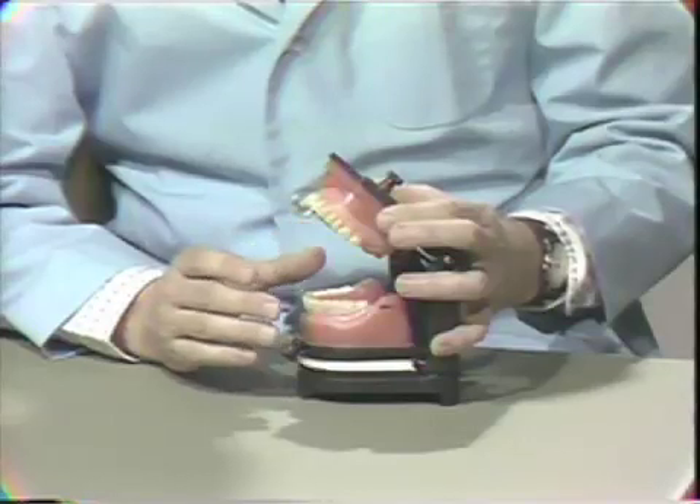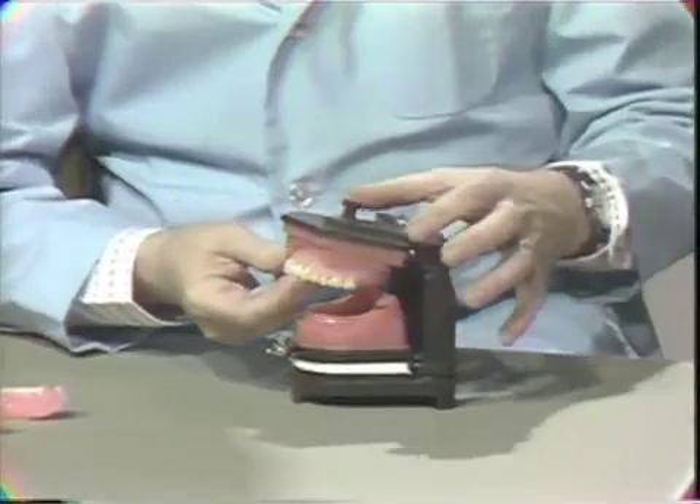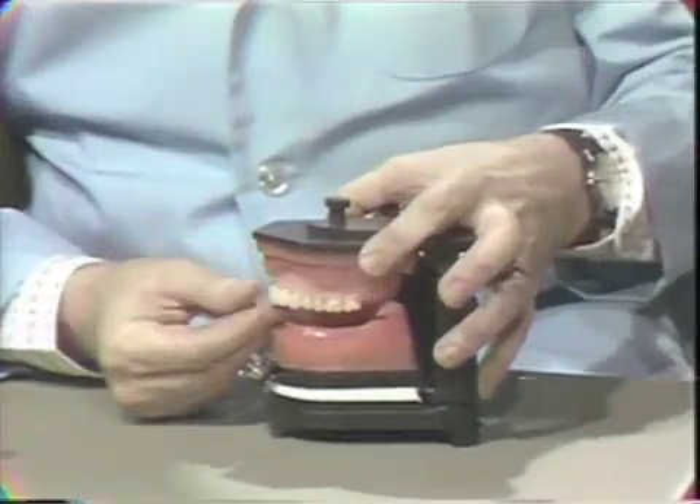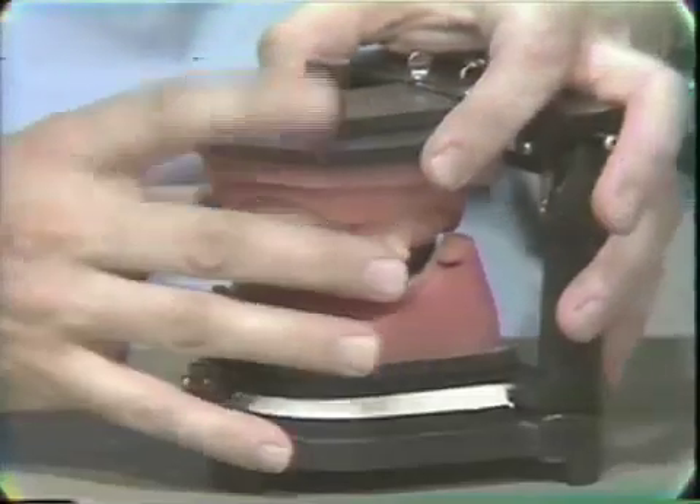We're going to do it a little differently in this exercise. Now there's one thing I should mention: how to transfer the maxillary denture in the face bow relationship so we don't have to take a new face bow after processing. And this can be done relatively easily.